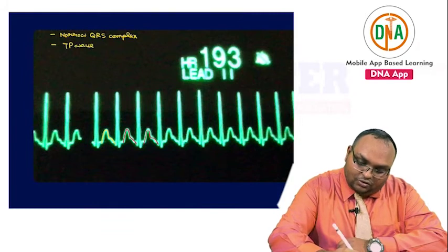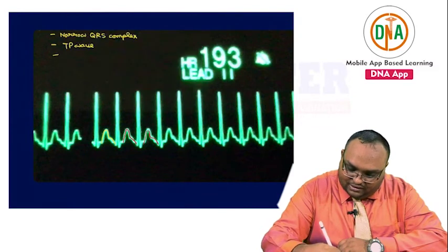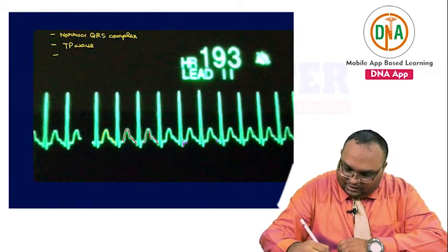Along with that, you can also see a slight ST depression over here. You can see a slight ST depression. See, ST depression, right?